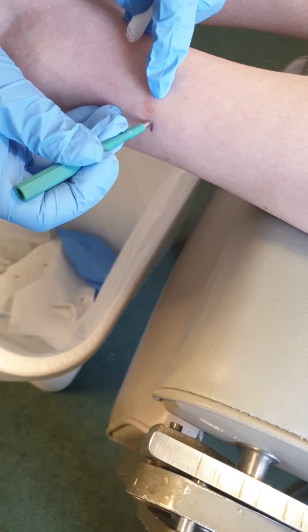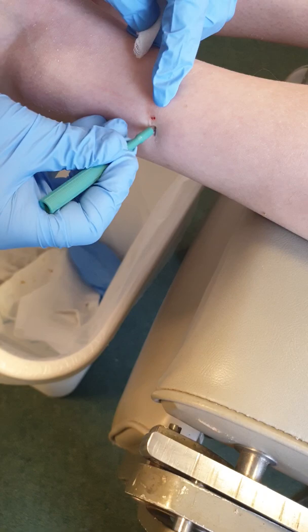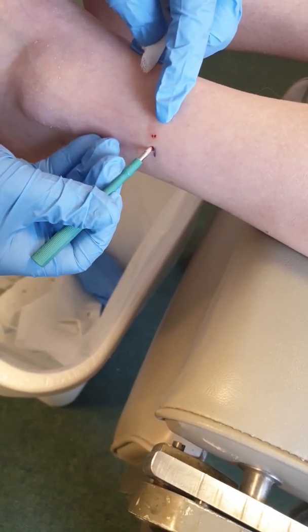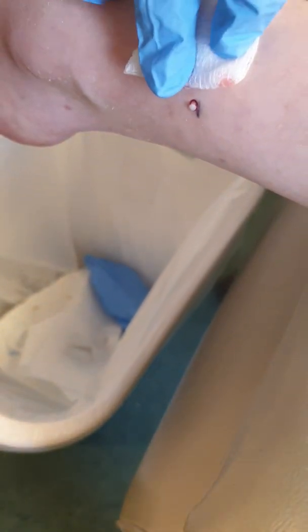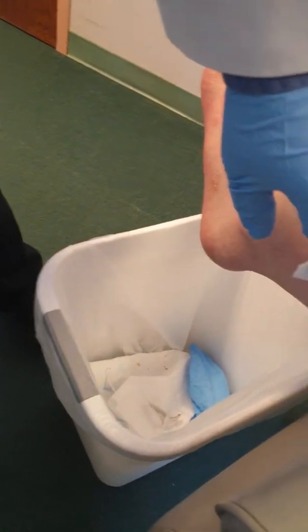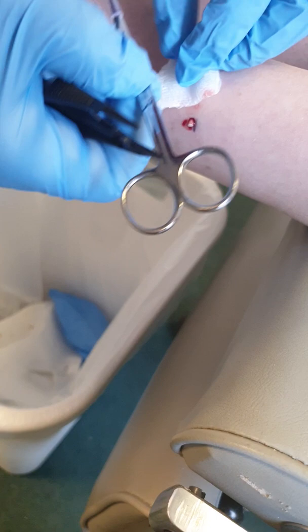All we do is perform a punch biopsy right next to where we did the mark, and I go deep. Are you feeling any of this? Not really, okay. And there's the plug, as you can see right there.